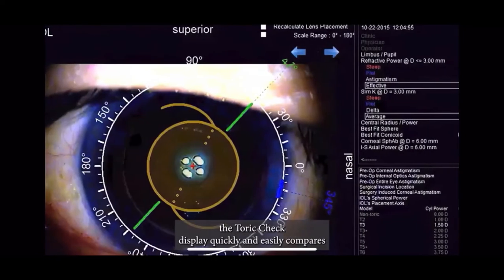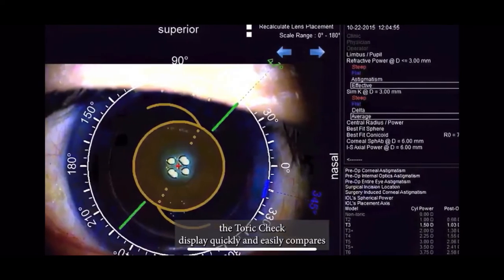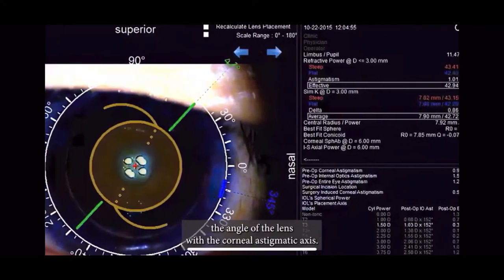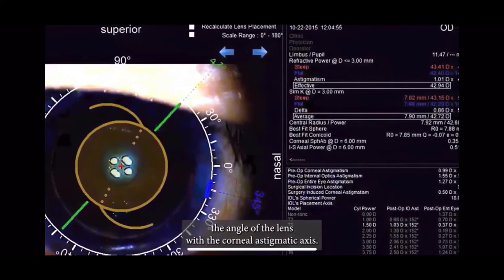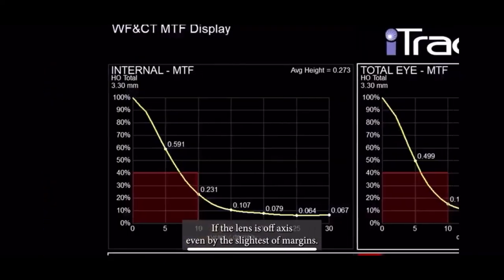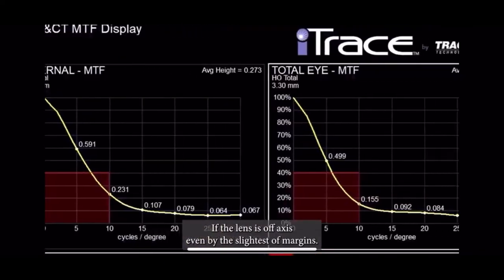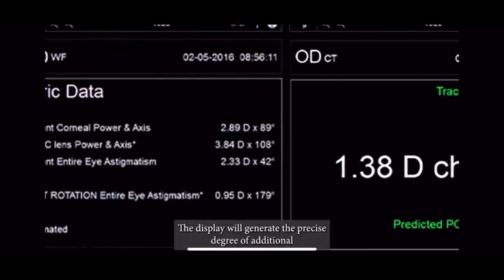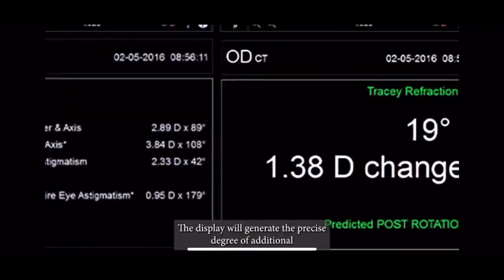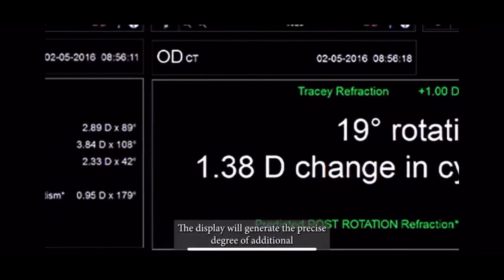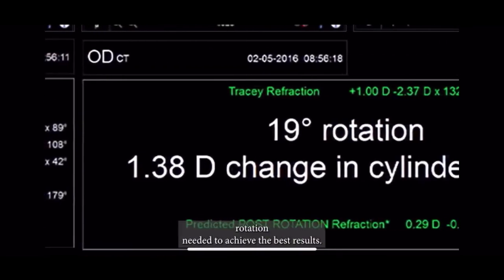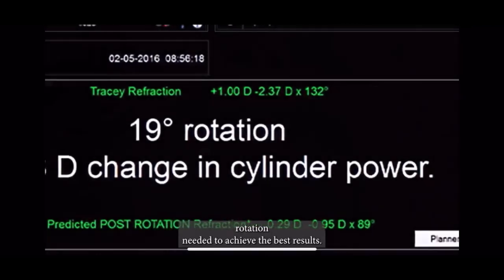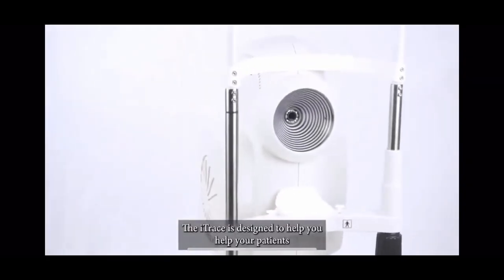The TORIC check display quickly and easily compares the angle of the lens with the corneal astigmatic axis. If the lens is off-axis, even by the slightest of margins, the display will generate the precise degree of additional rotation needed to achieve the best results.